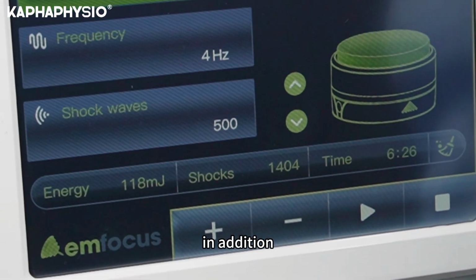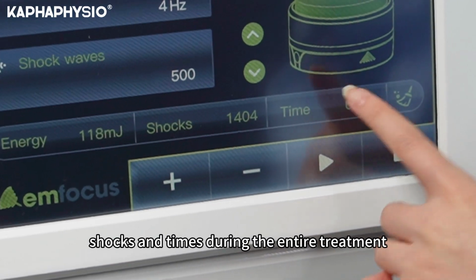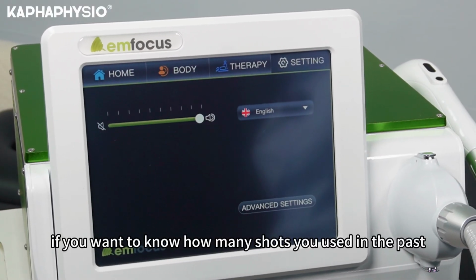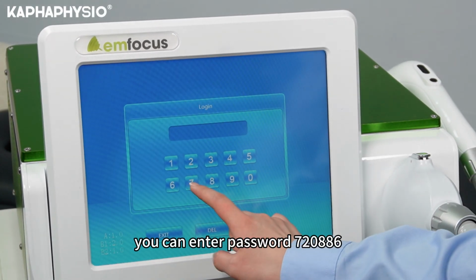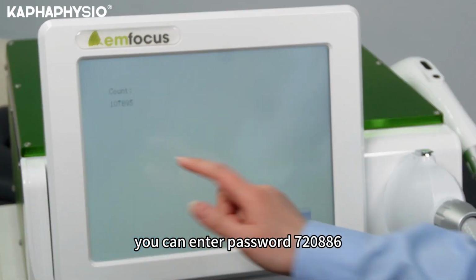In addition, you can see the total energies, shocks, and times during the entire treatment. If you want to know how many shocks you used in the past, you can enter the password in here.